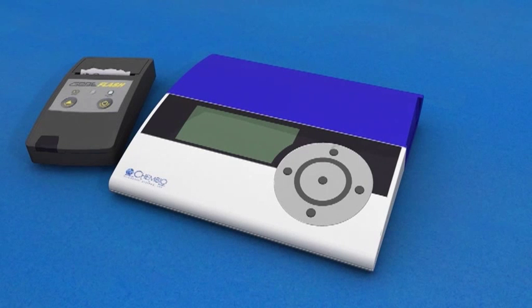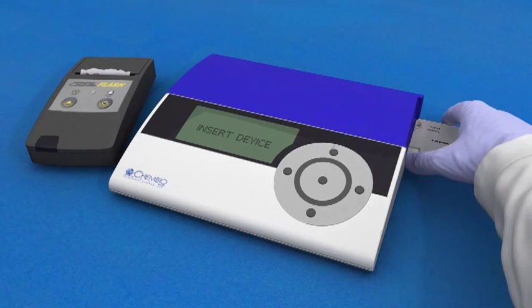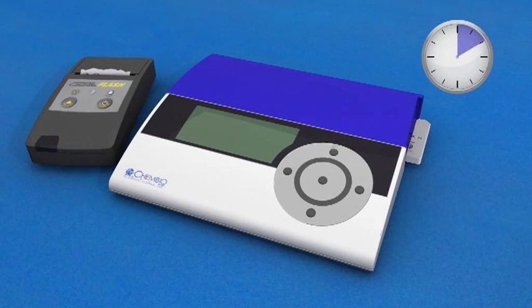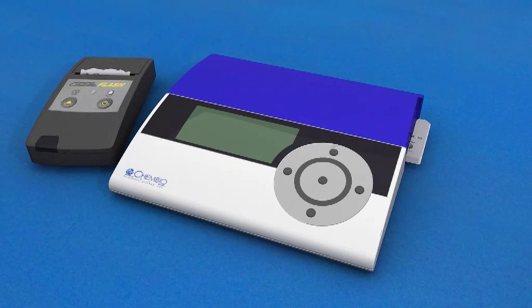DPP Reader. You can also use the DPP Reader to interpret your results. Start by pressing the black button on the side to turn the reader on. When the display reads READY, insert the DPP test at least 10 minutes but no later than 15 minutes after adding the running buffer from the green cap bottle. The reader will display the word TESTING for a few seconds before the results are shown.